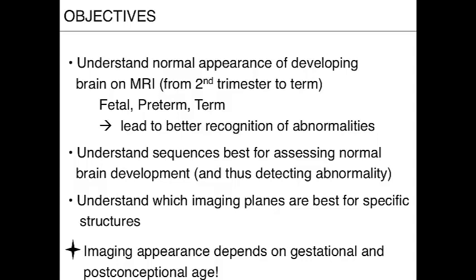And I do want to emphasize here and throughout the lecture that really when you are assessing the appearance of the developing brain on MRI, it's very important to know the gestational age for fetal MRI and the post-conceptional age for evaluation of neonatal brain on MRI.